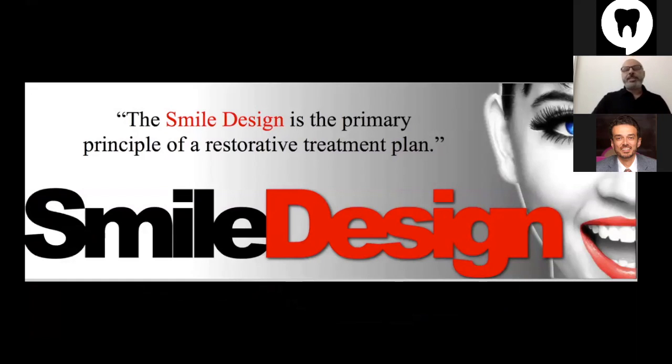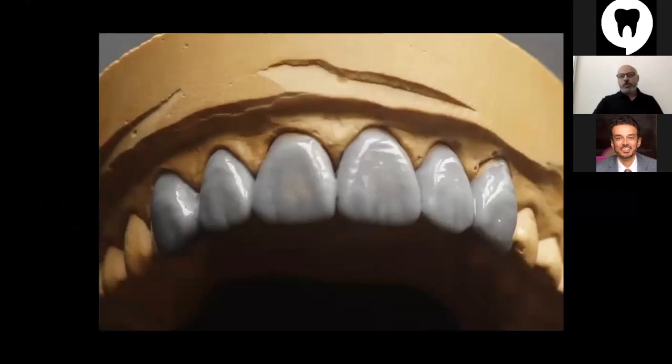So you can do smile designing whichever way you like, with digital or manual means, but at the end, you need to design, not just go ahead and start your work without any design. You can go the analog way like that. This is a very nice wax-up made for the anterior teeth with very fine details.